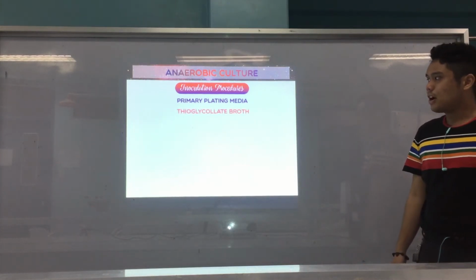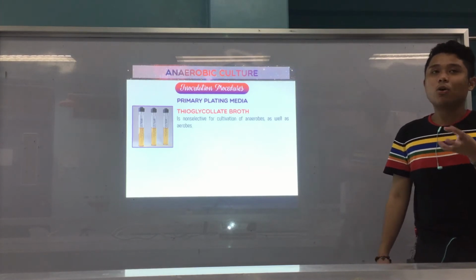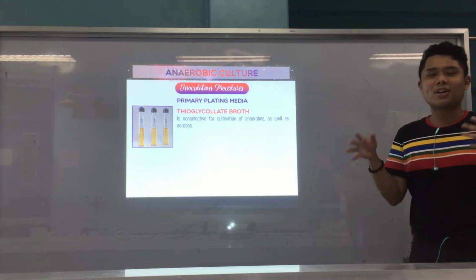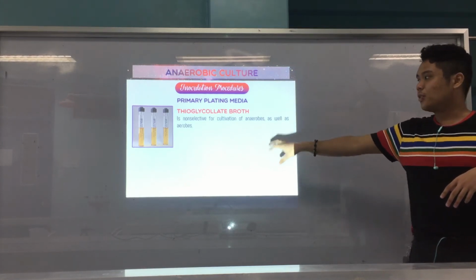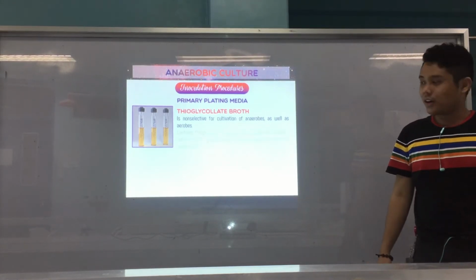Okay. Alright. Now, we also have the thioglycolate broth. Usually, your thio broth is not only for anaerobes. Pwede po siya magamit for aerobes. Basically, it's an all-around broth. Actually, pwede siya magamit, no? Pero, for anaerobe purposes, again, non-selective siya for anaerobes. Pwede po for aerobes. Okay?